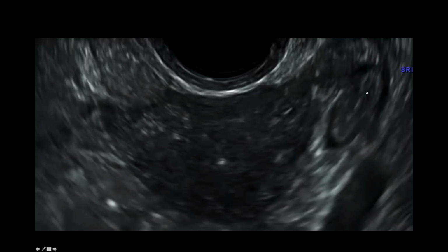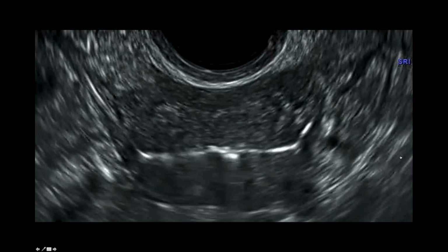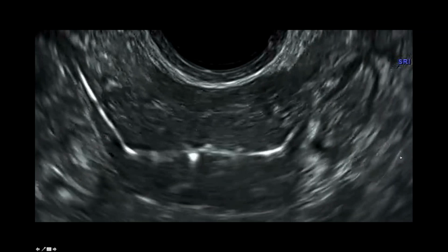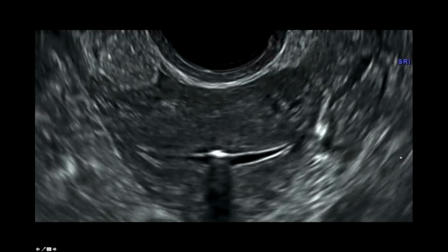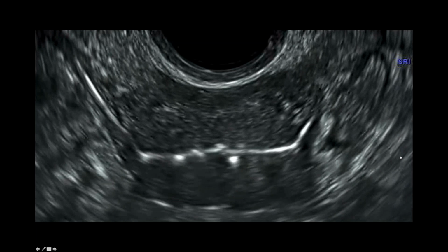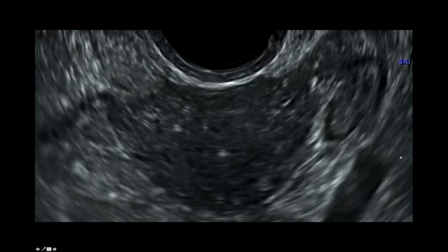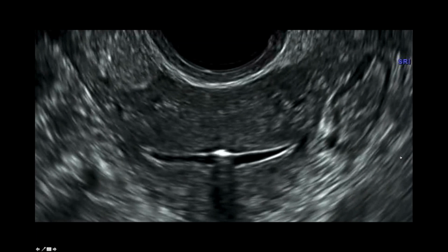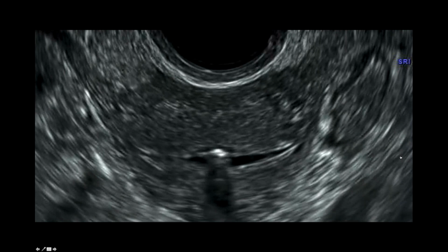Sometimes we get lucky and a patient has anatomy that allows us to look at both sides at once. So here we're transverse on the uterus. And you can actually see the air bubbles coming out on both sides. We always try to do this view first, because if you can see air coming out of both sides right away, it saves the patient further air and fluid, which does cause cramping, and the procedure is finished much quicker. But I'd say that this happens probably 25% of the time that we can see them coming out both sides.